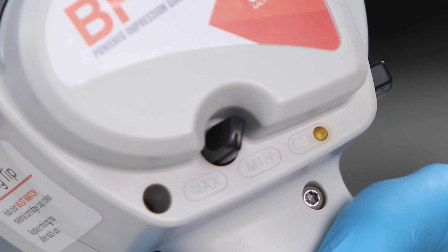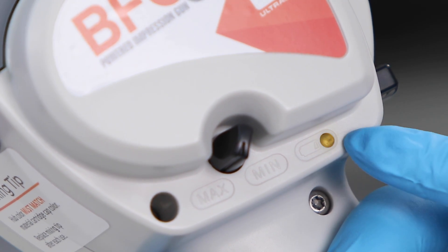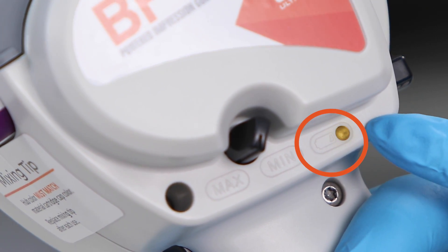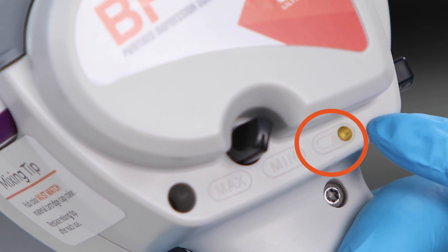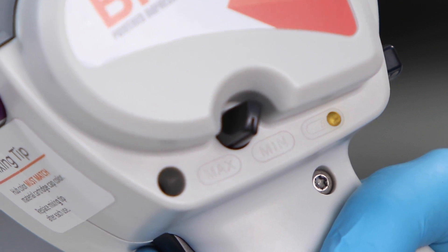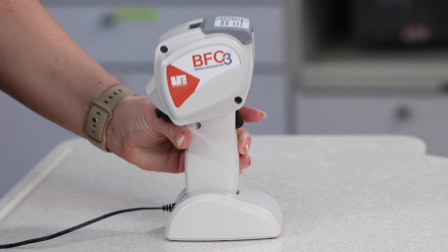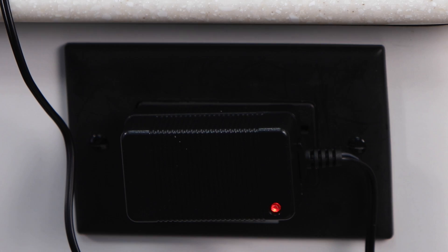When battery output is reduced, the low battery LED will indicate that it should be charged soon. The BFC3 Impression Gun will dispense up to 10 full cartridges after the low battery LED light comes on. The base is designed to hold the Impression Gun while the battery charger is connected. When the battery is fully charged, the LED indicator on the battery charger will change from red to green.